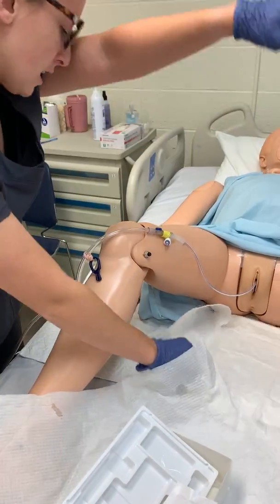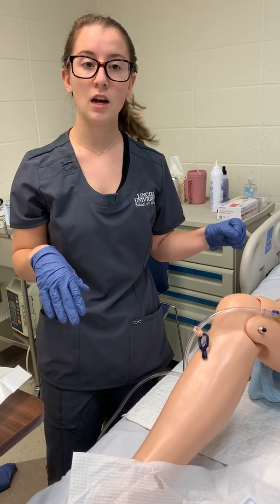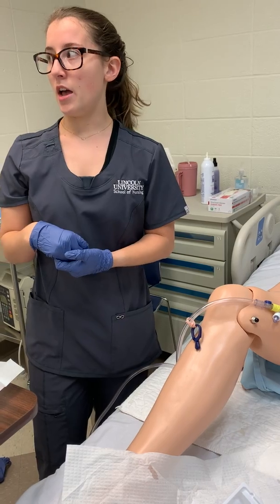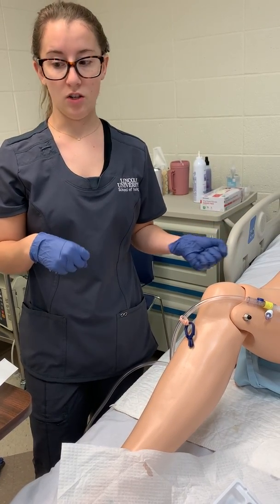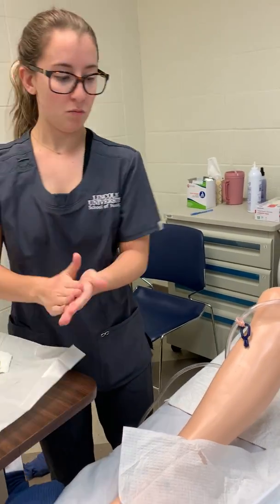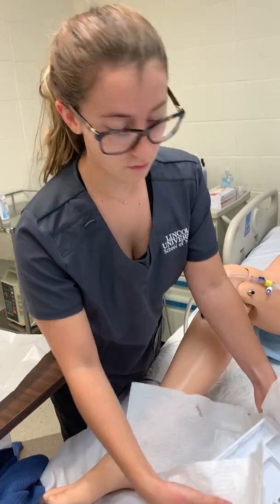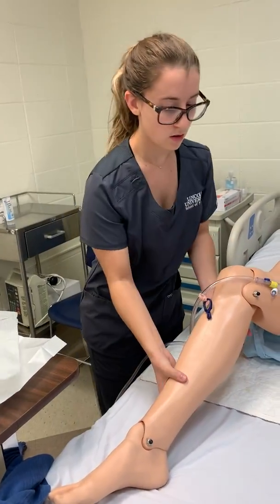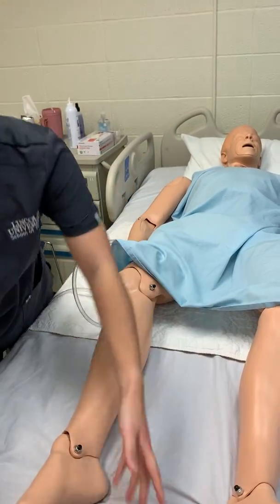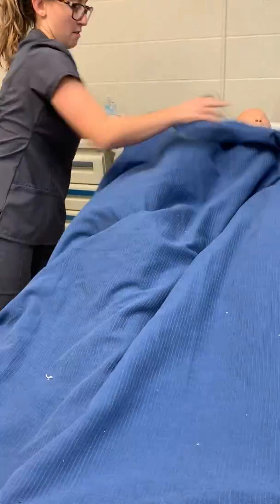And also at this time, if the doctor ordered a urine sample, I would go ahead and collect that at this time. Also, just make sure that she is voiding into the bag, and examine the urine if I needed to. Now, perform hand hygiene once more. Get this out of the way. Reposition my patient to a comfortable position for her. Lower the bed down.